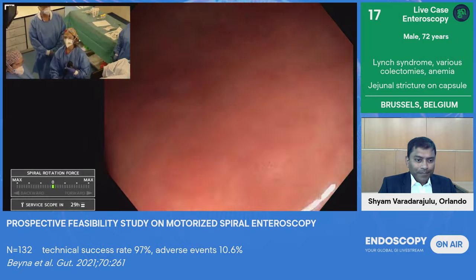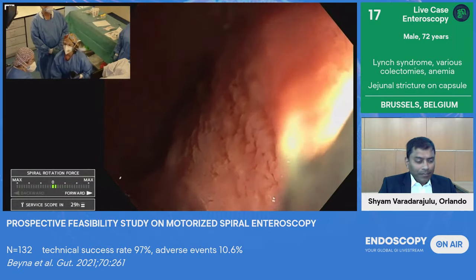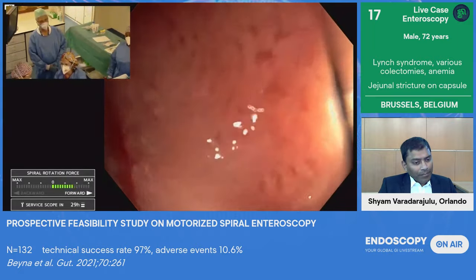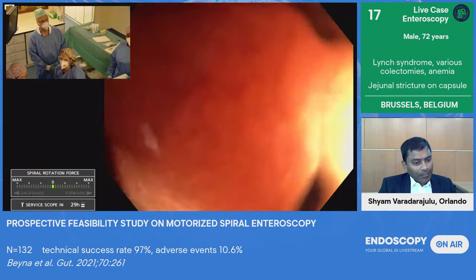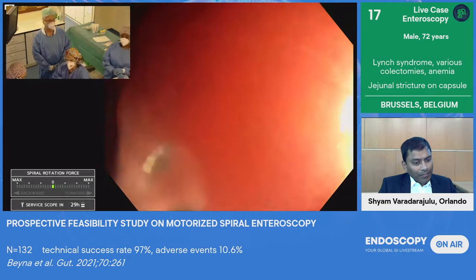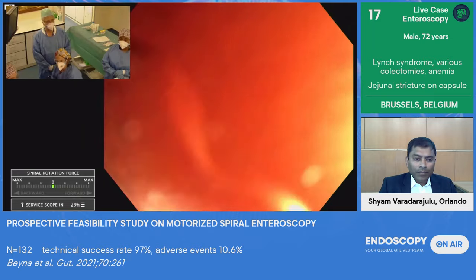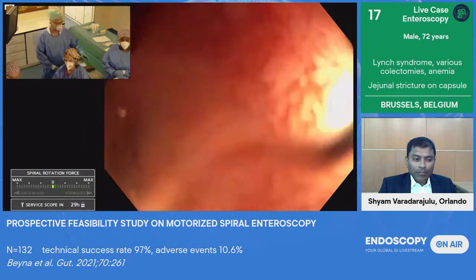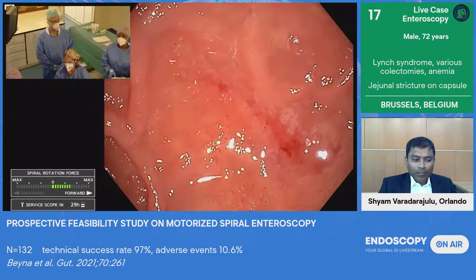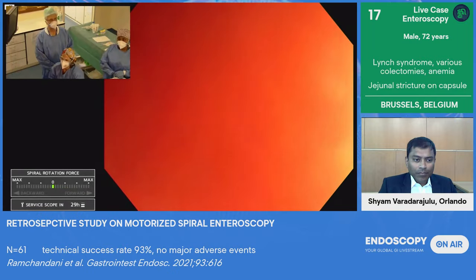And we will do the normal endoscopy until the pylorus and second duodenum by applying forward movement on the spiral, the motor. There is also a role for generous irrigation once we are in the small bowel, in order to increase the liquid content and allow us a better advancement. There is also some role of the assistant to jiggle the scope sometimes. And this is why Francine is there, ready to help if we need some help for advancing the endoscope.